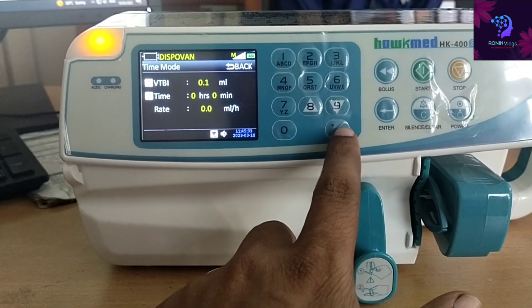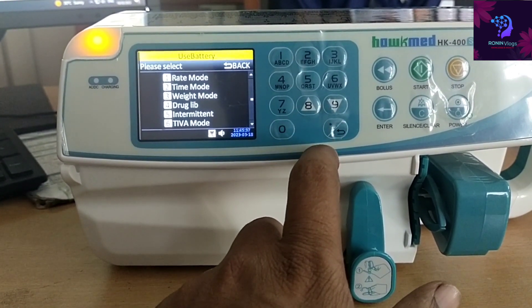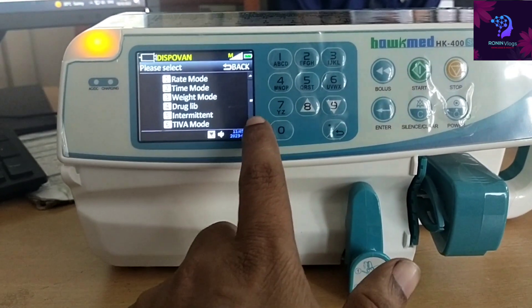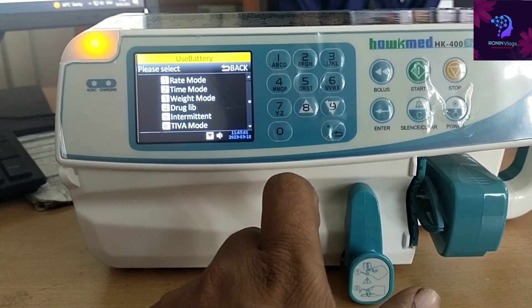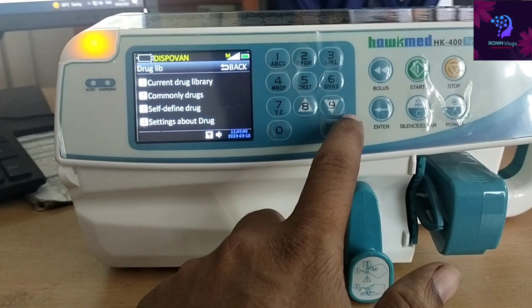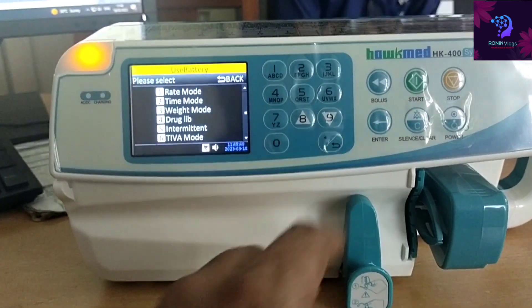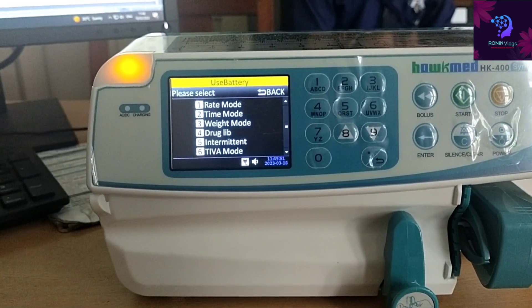Whichever mode we want to select, just press the corresponding number. Mode one, mode two, and so on. Up to six modes are available — just press the number of the mode you need.